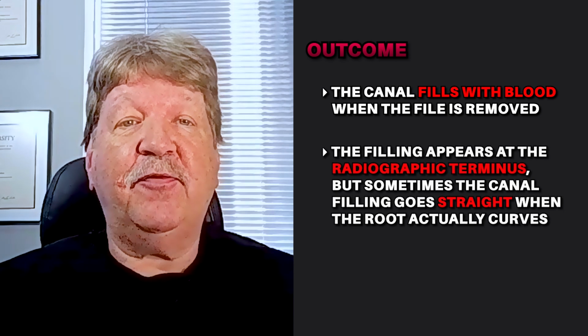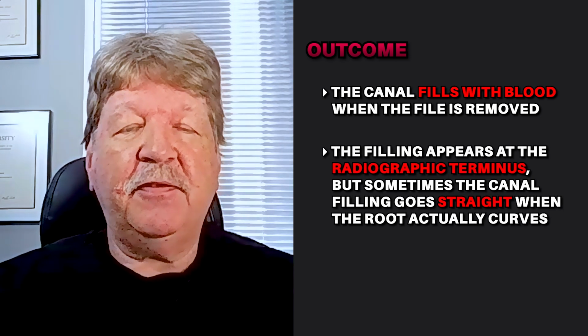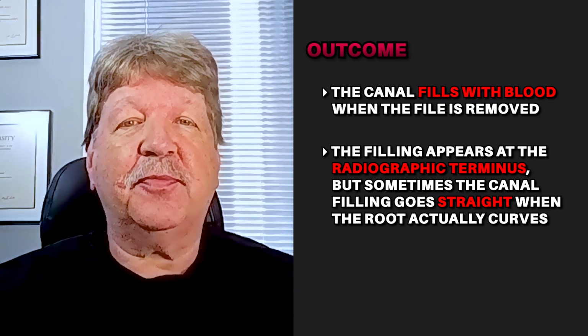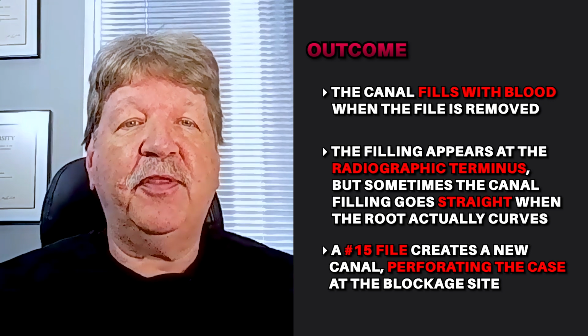When the case is finally filled, the filling appears to be at the terminus, but many times your canal filling goes straight when the root actually curves. We've made our own canal with a number 15 file and perforated the case at the blockage site. So how do we prevent this?